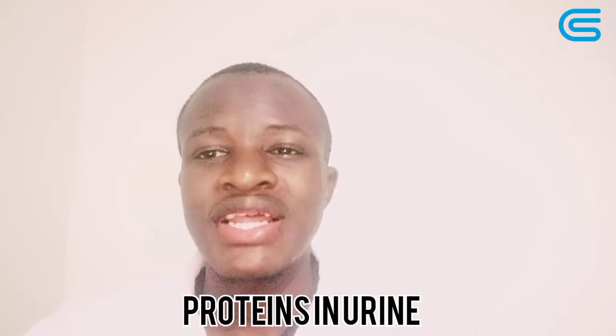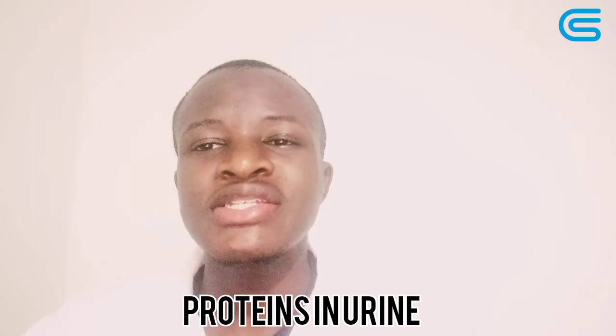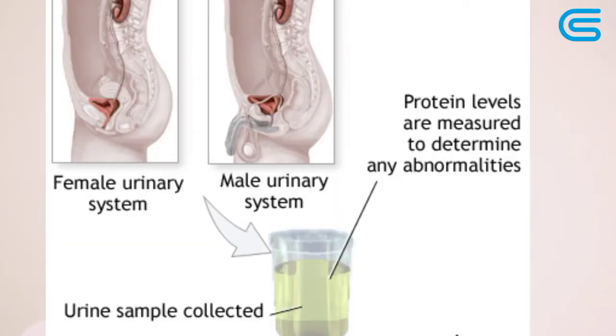The very first component that I want us to speak about in chemical analysis of urine is proteins in urine. Proteins in urine is a phenomenon that we refer to as proteinuria. Normally the kidneys excrete a scant amount of protein in urine, up to 150 milligrams every 24 hours. This amount cannot be detected in routine lab tests when we are doing urinalysis.